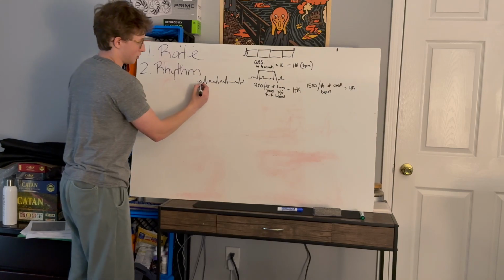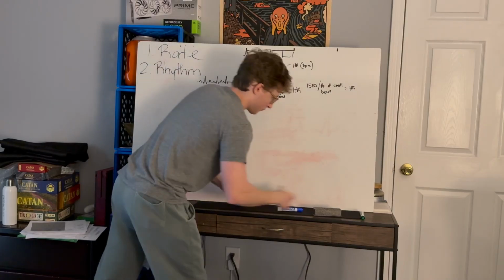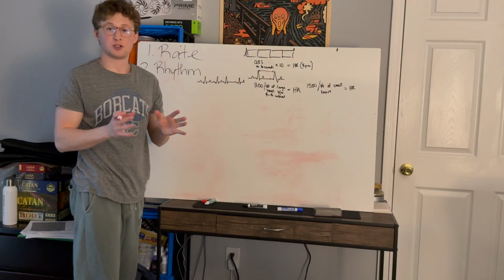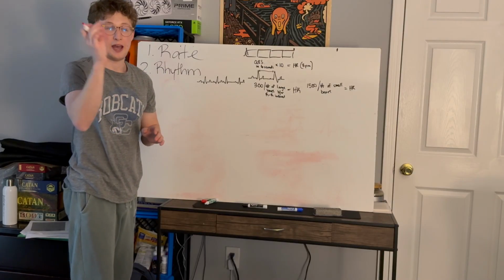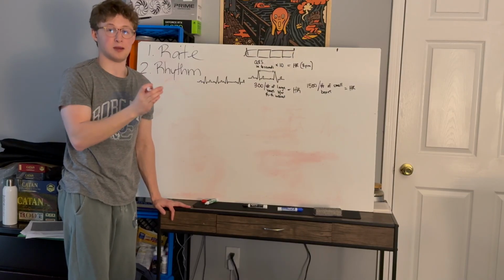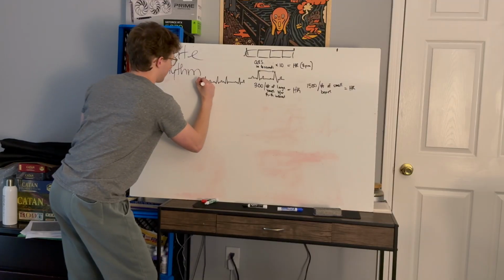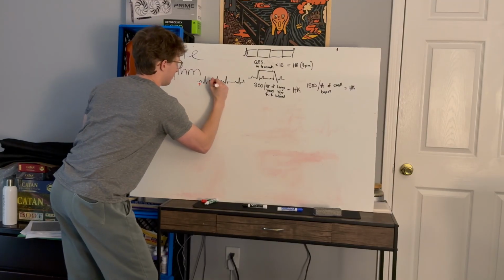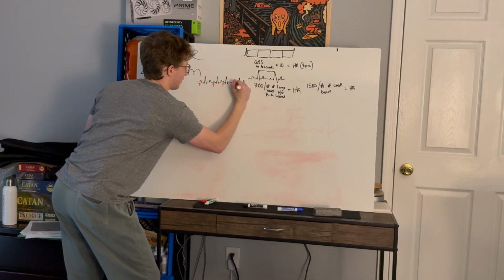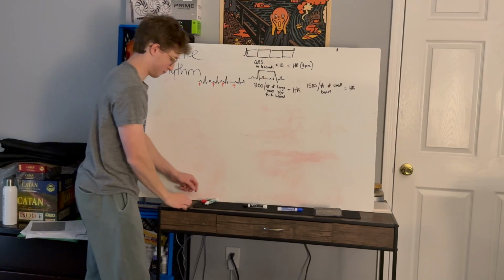So you can either measure P waves. Rhythm can be measured by looking at the P waves and measuring the distance between each P wave, and is it consistently the same distance? So P to P interval. So looking at your P to P interval is one way to do it.